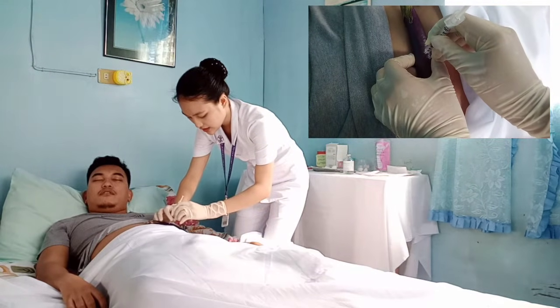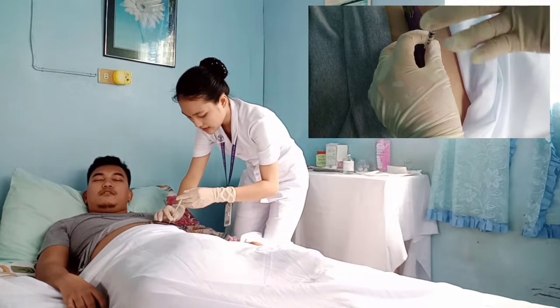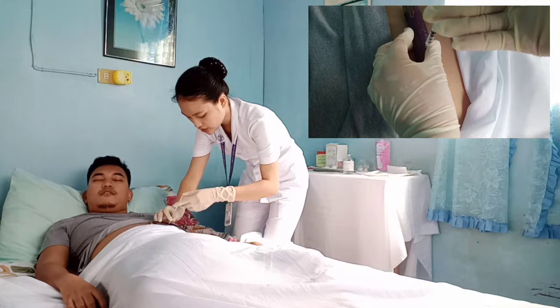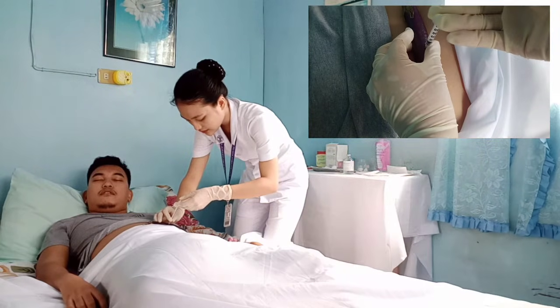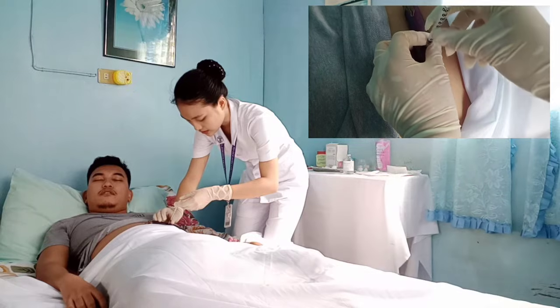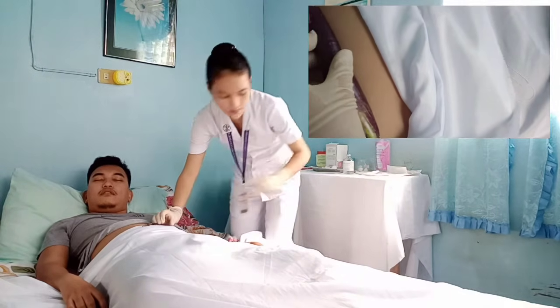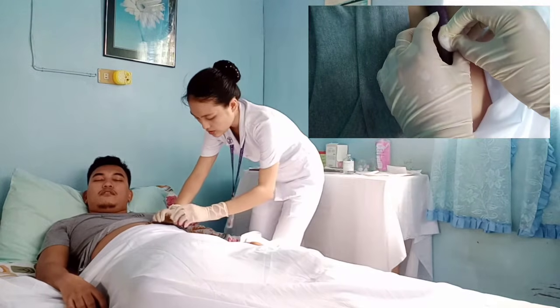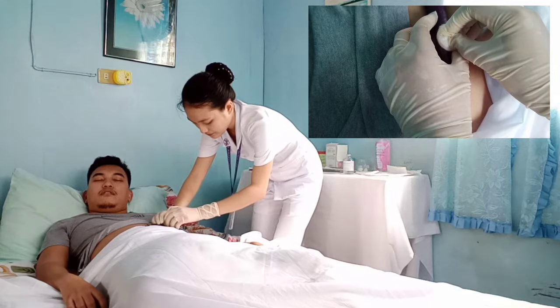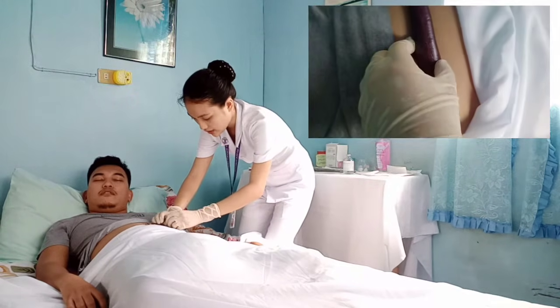Release the pinched skin and rest the non-dominant hand on the patient. Move the dominant hand to the end of the plunger and slowly inject the medication over several seconds. Retain the grasp on the syringe to keep it still. Now quickly withdraw the needle. Place a swab or gauze on the site and apply gentle pressure, but don't massage the area.